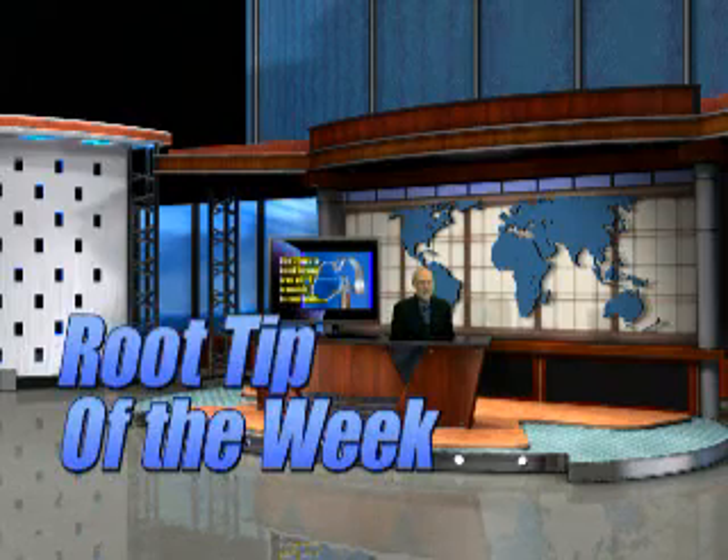Hi, once again, I'm Dr. Kit Weathers, and this is the Root Tip of the Week. Today we're going to be talking about rubber dam clamps. The good news is there's only three clamps that you will ever need to buy, and I'll show you how to modify those clamps so they will fit in any tooth in the mouth. Let's look at those three clamps right now.